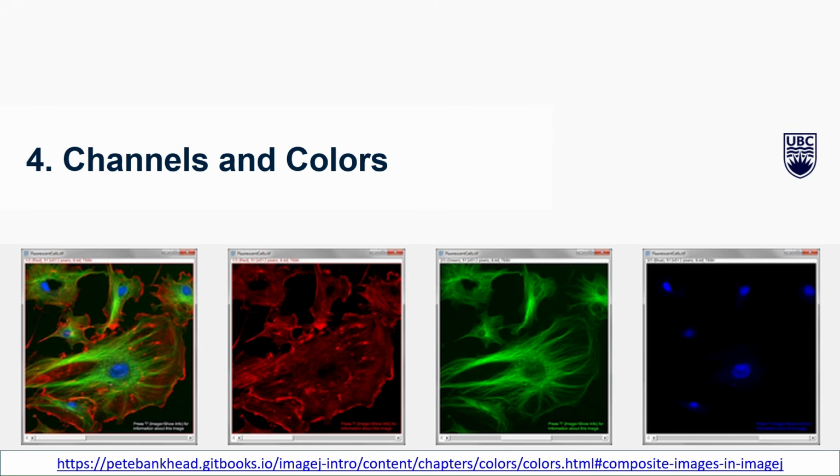and colors. In the previous module, we discussed digital images, pixel values, lookup tables, and image histograms. In this module, we'll build on those concepts by exploring how image data are visualized using color. Understanding color representation is particularly important in multiplex immunofluorescence because we frequently work with multiple markers, each represented by a separate image channel. The way we choose to display these channels can greatly affect how easily we interpret the data, even though underlying measurements remain unchanged. We'll also discuss different types of color images, and examine how various color maps or LUTs influence image visualization.